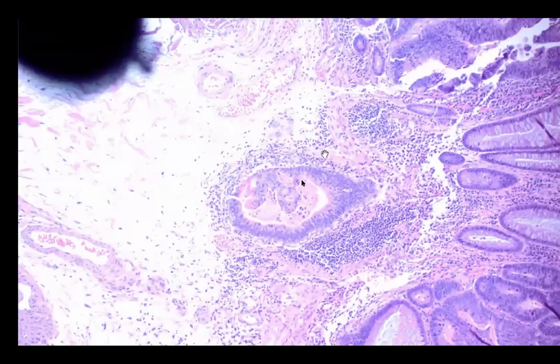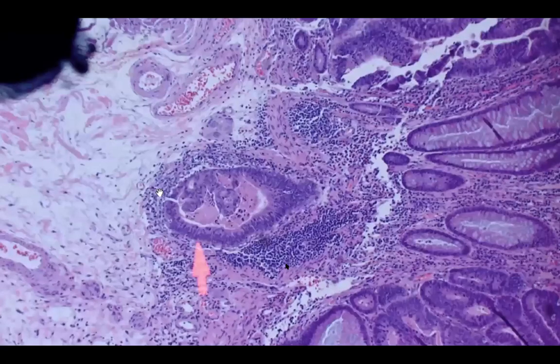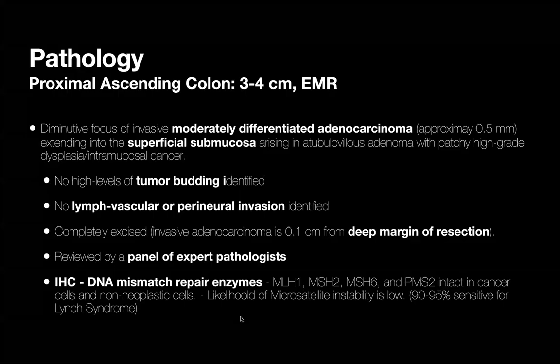This pathology is very interesting. I'm going to go to the next slide. That's the gland that has penetrated the muscularis mucosa, and this is a copy of the pathology report. I want to read this out for you.